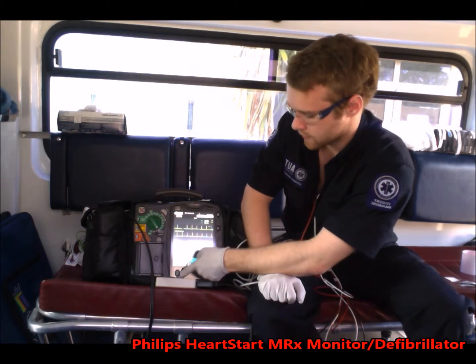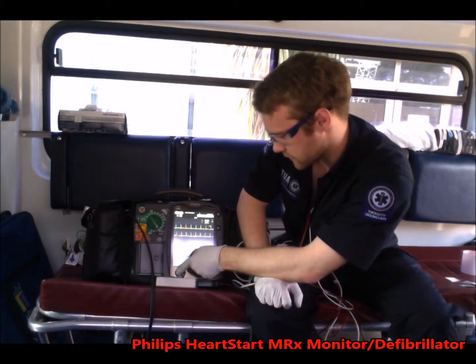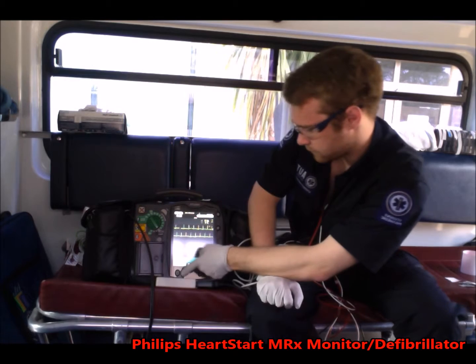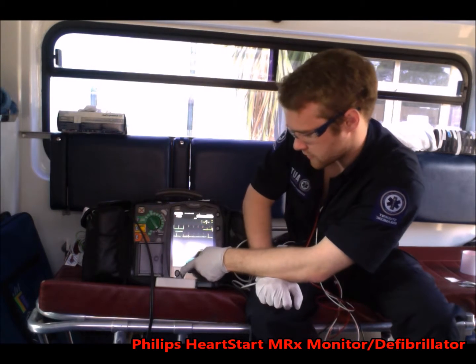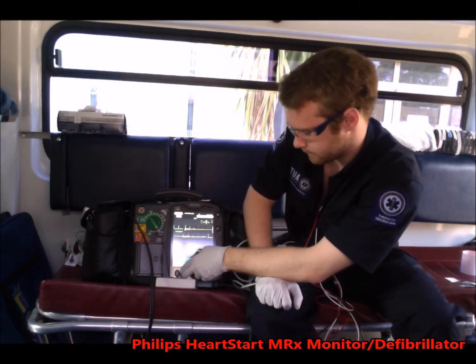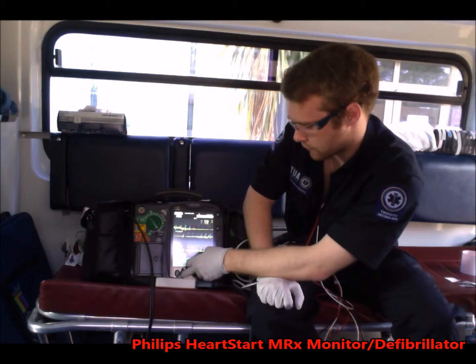We can adjust the amplitude of the ECG by selecting the displayed waves. Wave 1. And we can adjust the amplitude by just selecting the size that we want. It's times 4, times 2, times 1, half, or a quarter.